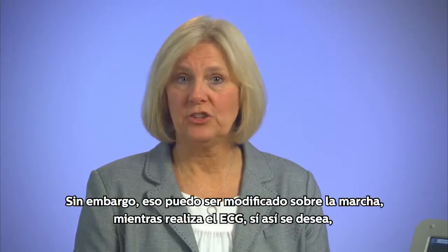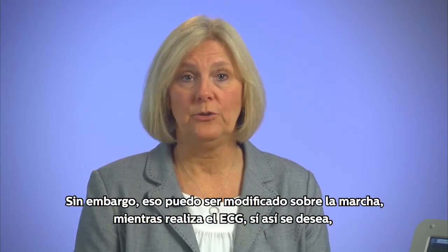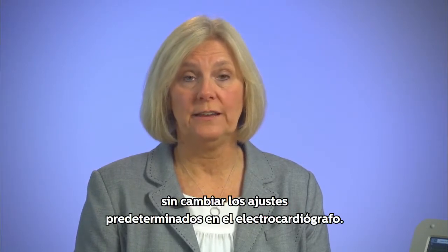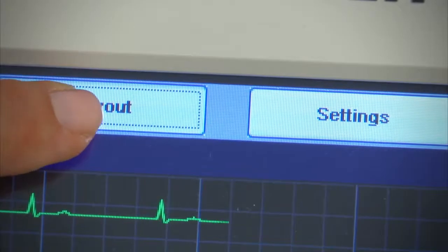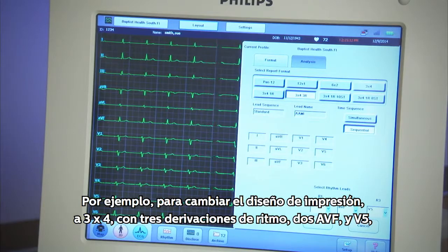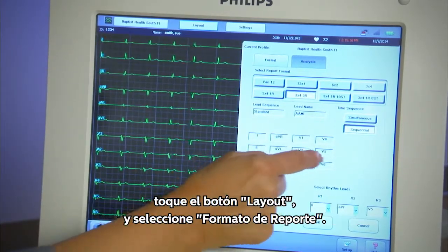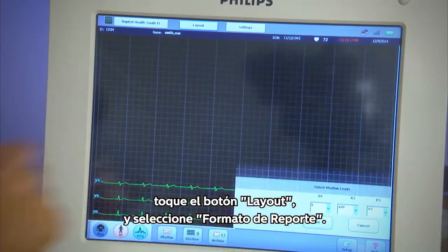However, that can be changed on the fly with the current ECG being taken if desired, without changing the default settings in the cardiograph. For example, to change the print layout to 3x4 with 3 rhythm leads — lead 2, AVF, and V5 — touch Layout and select Report Format.